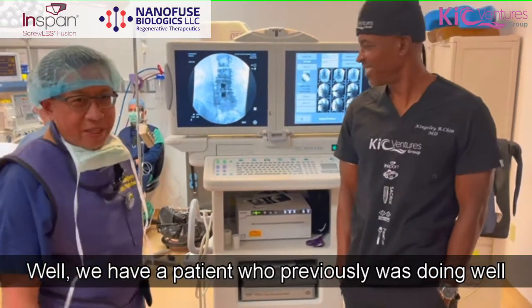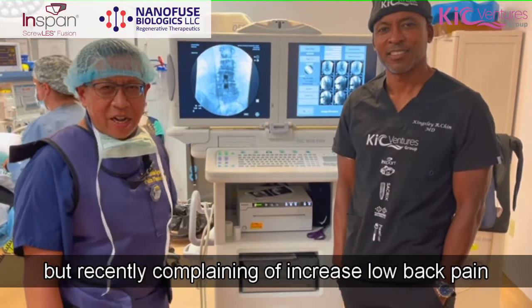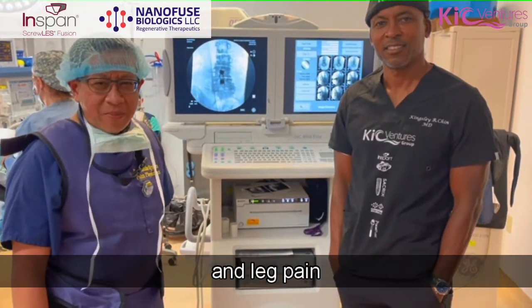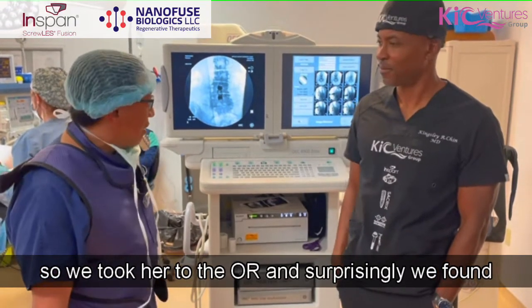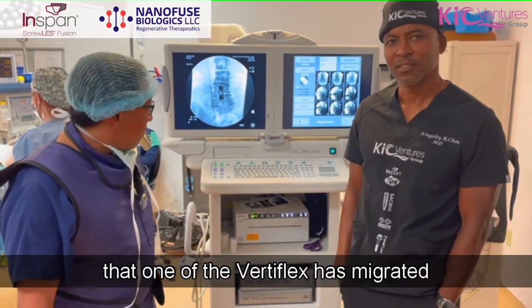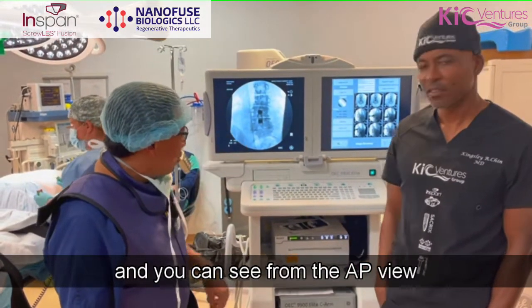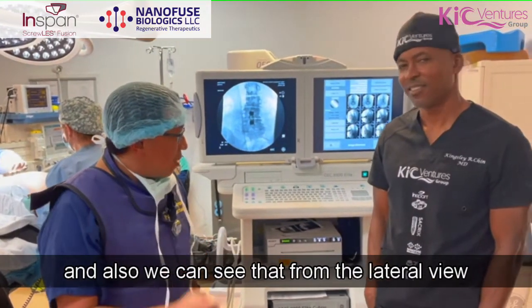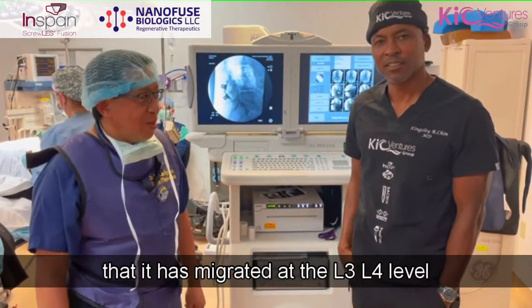We have a patient who previously was doing well with the butterflies, but recently complained of increased low back pain and leg pain. So we took her to the OR and surprisingly found that one of the butterflies has migrated. You can see from the AP view and also from the lateral view that it has migrated at the L3, L4 level.